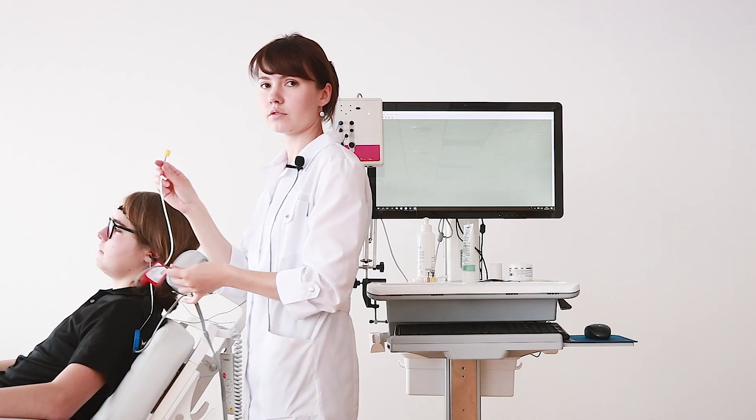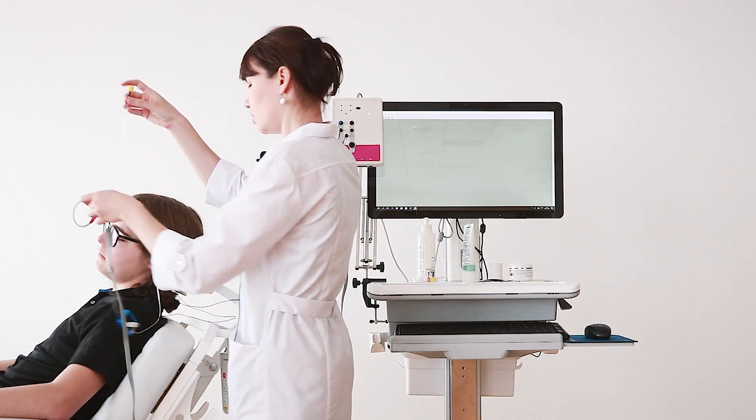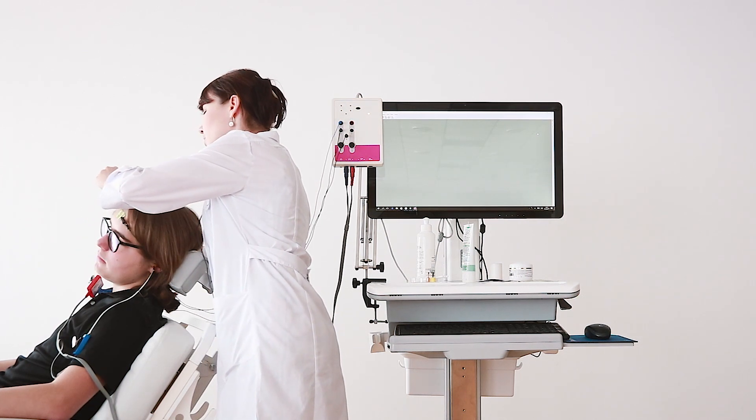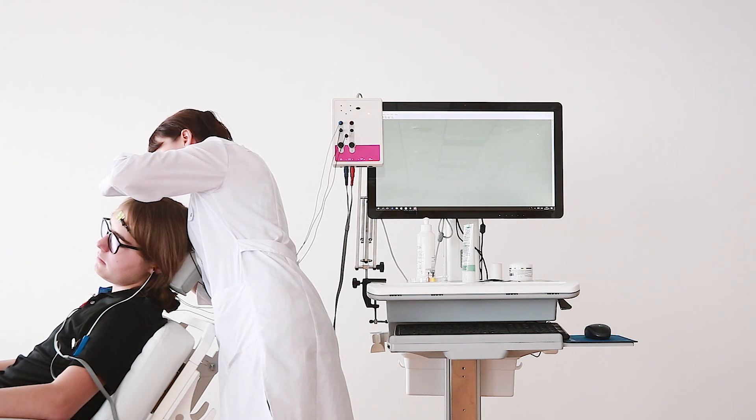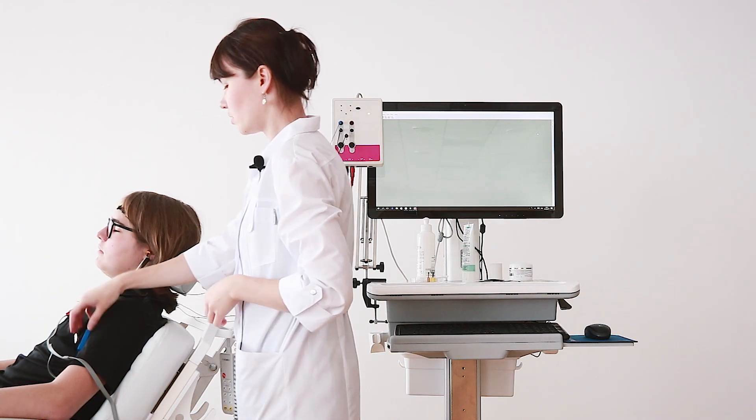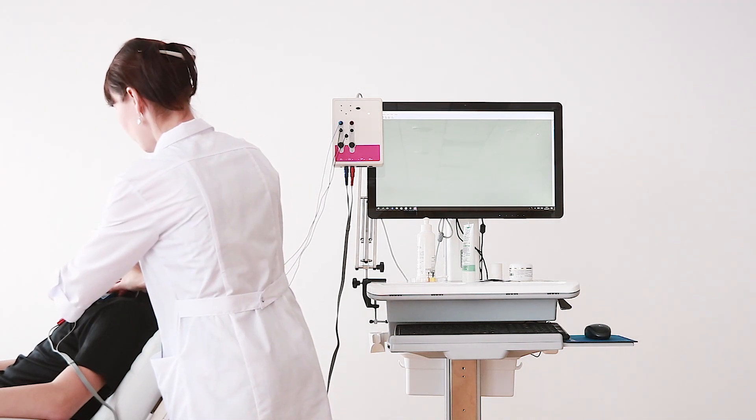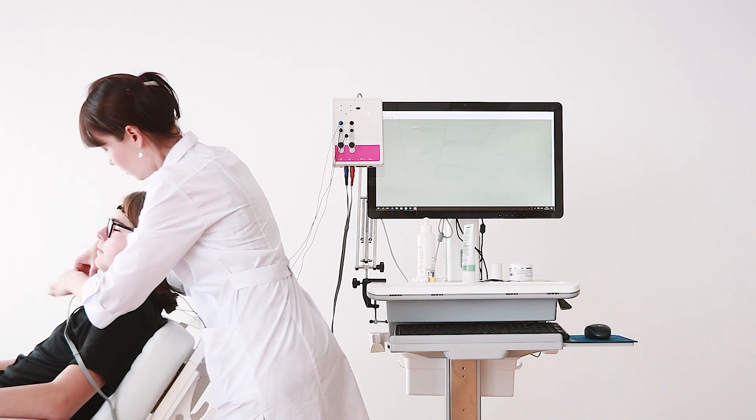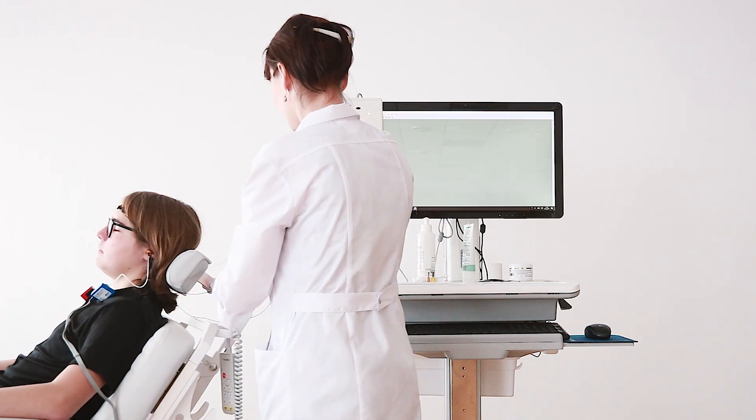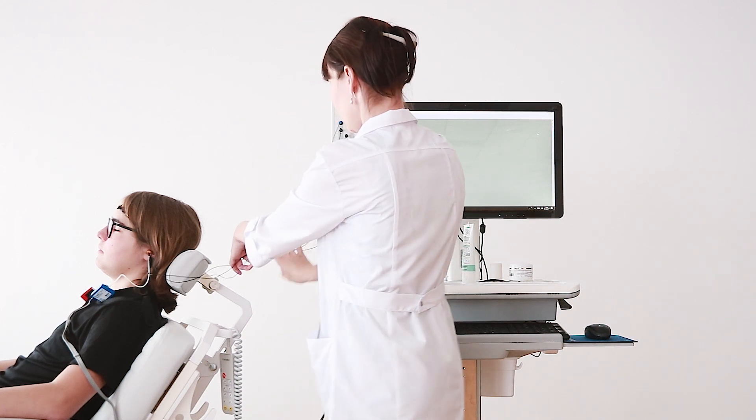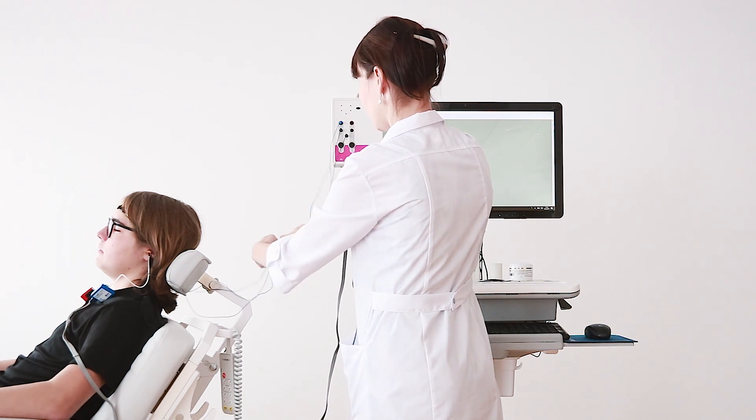On the other side, in the right ear, we use a simple tip of insert earphones. We insert it the same way. To fix the earphones firmly, we can use the patient's clothes and special clips. Now we collect the cables together to minimize the mains noise.